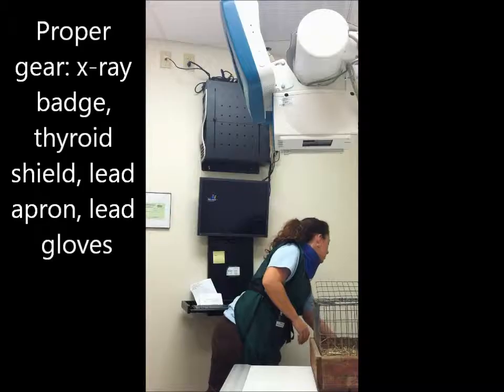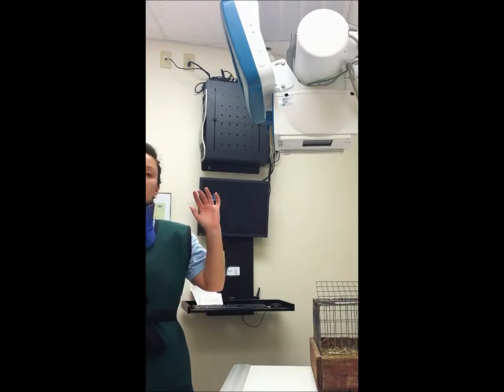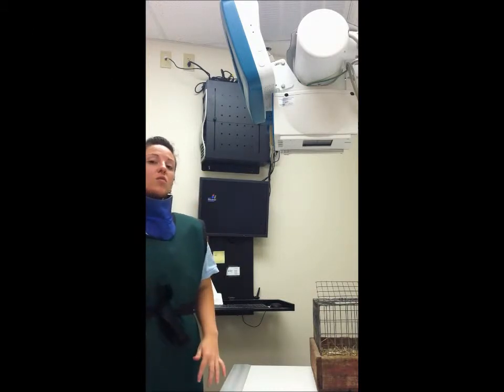We did use a live bird today in our x-ray video. However, the dove was not very cooperative, so I tried to demonstrate a manual view of a right lateral recumbency. However, again, the most effective is the chemical restraint, but if you cannot do chemical, manual is more than likely the least conducive for restraining. It is recommended to do anesthesia or some kind of light sedative, usually with a mask. This helps. So we would put that information into our x-ray machine. Again, the KVP will be a little lower, the MAS will be a little bit higher.